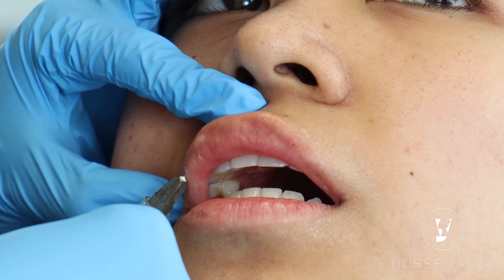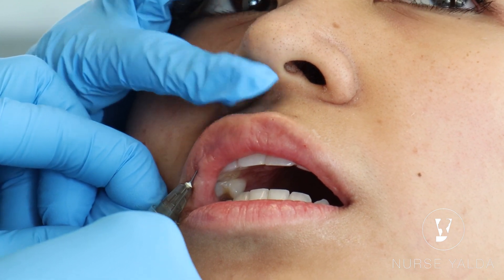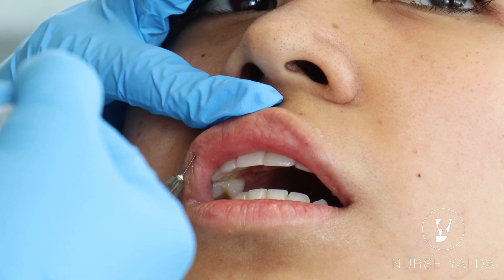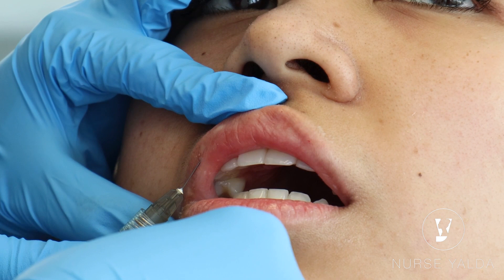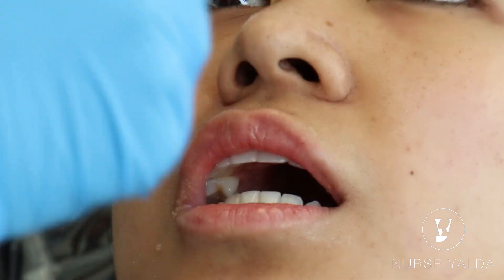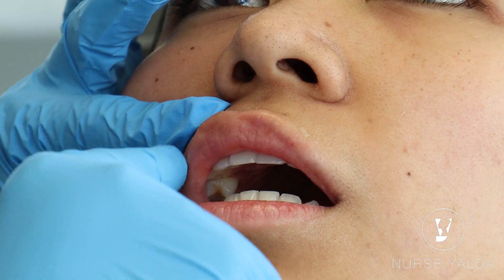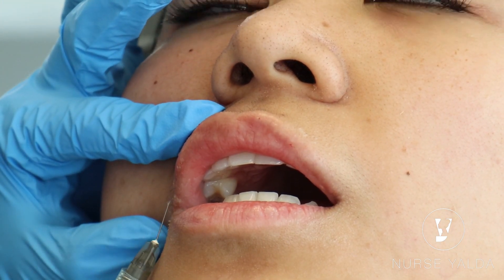Here's a little trick: with this finger give support to your syringe, then push and pull back. You see? You have more of a steady hand — the syringe doesn't move around. Now from the oral commissure, just a little bit. Remember the lip anatomy: on the lateral portion of the lip, they're a little bit smaller, so you want to add a lesser amount.